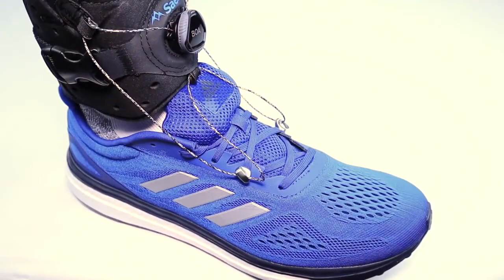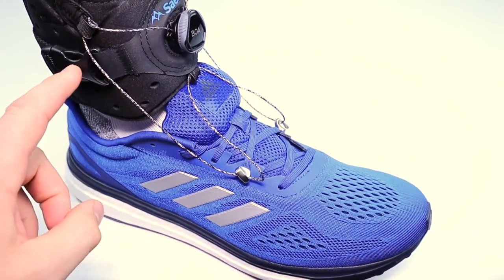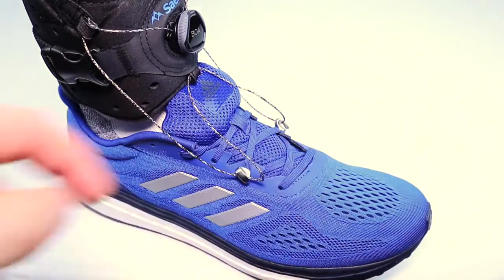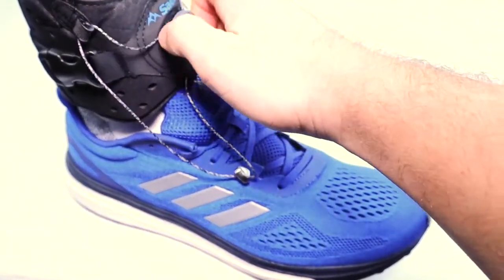Here is what the Sabo Step looks like when it's on. Once you have tightened it around your ankle and secured it with the clip, put the lace through the hooks, then push in the BOA dial and tighten until it lifts your foot.